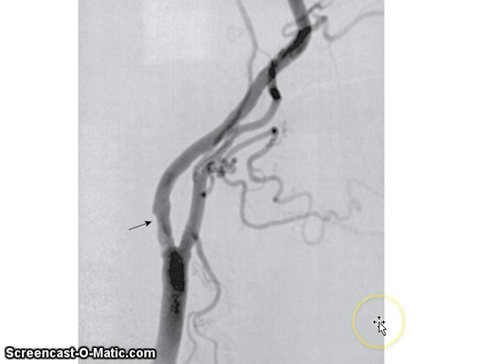Here's another example. This time the patient is facing the other way, because again here we've got the internal carotid, we have the common carotid here. It branches off into external here and internal here. So the external carotid artery, again, the one that has all the branches, so the patient is facing like this, this would be their eye. Then this is the internal carotid artery. It's the one that courses on all the way up into the brain.